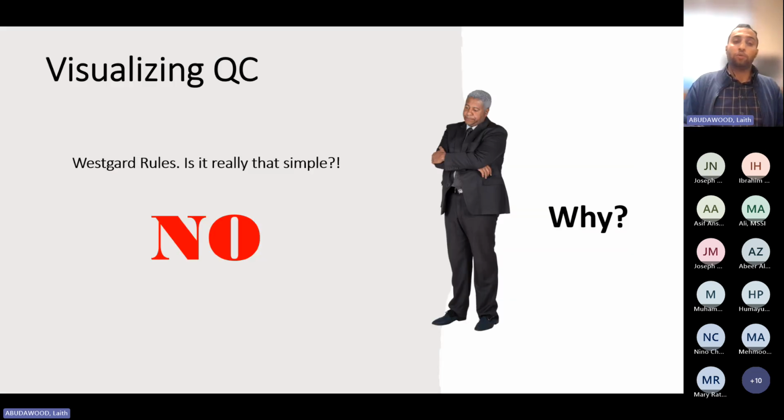Now, you have to know that using Westgard rules is not just, I have all of these rules of Westgard, I will use all of these rules of Westgard. It's a little more complicated. And there is one very critical mistake that many labs make with Westgard rules. You do not apply Westgard rules to manufacturer ranges.